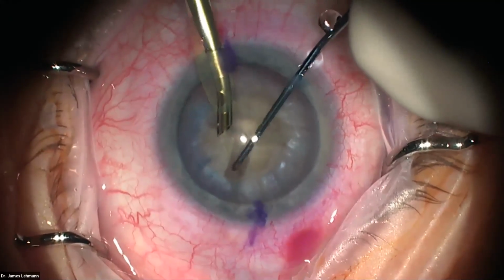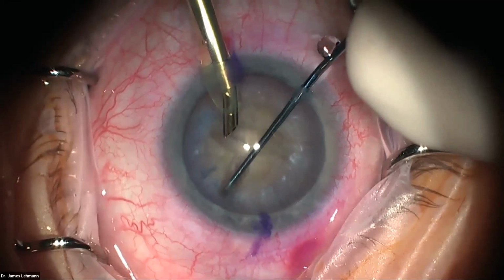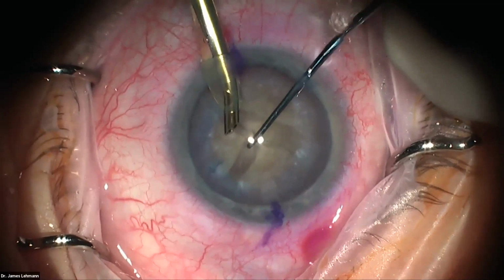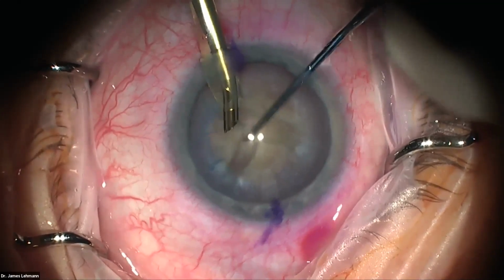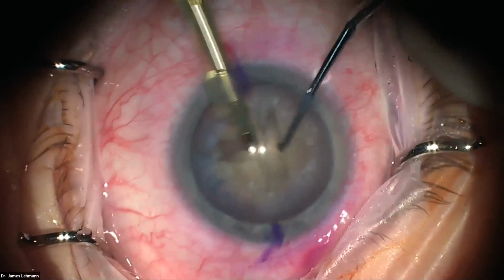And rotating a nucleus is like opening a door. If you go out peripherally, it just takes a little bit of effort and it spins. If you try to do it centrally here, look, you just push it to the side. You're not using the torque that you need. So you've got to go out peripherally to rotate a lens nicely.